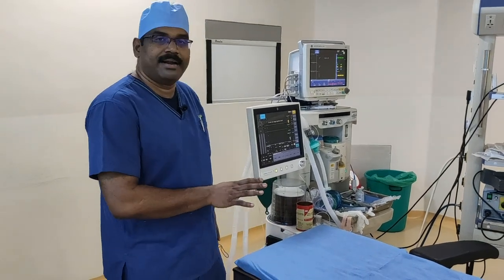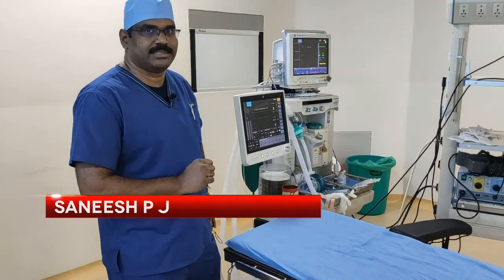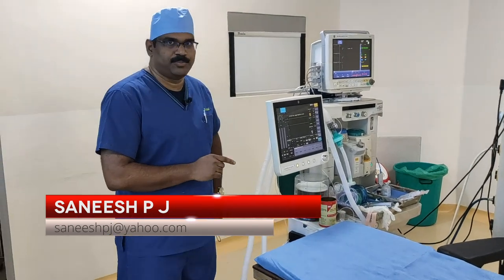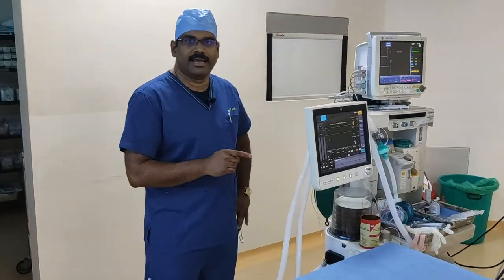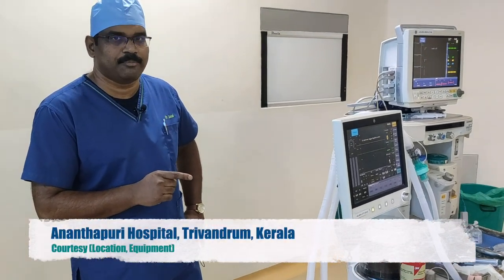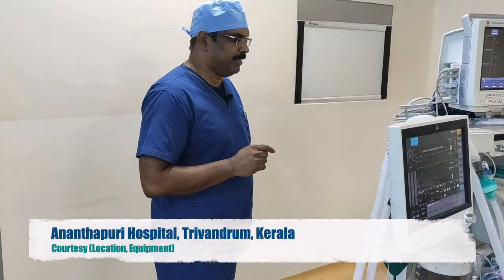Hi, this is the theatre getting ready to start our first case. But I want to try something new now. I am going to connect an oxygen cylinder to a nitrous oxide hanger yoke assembly. Let's see if it is possible.